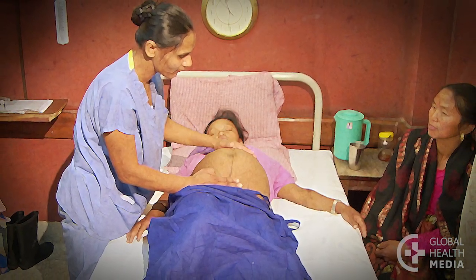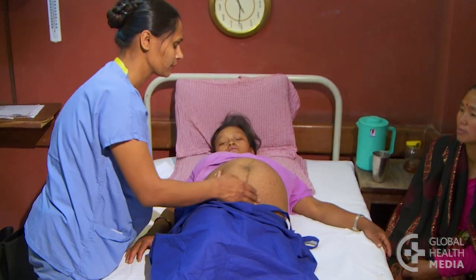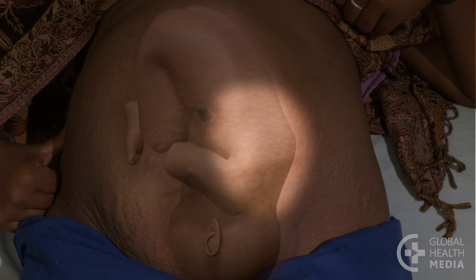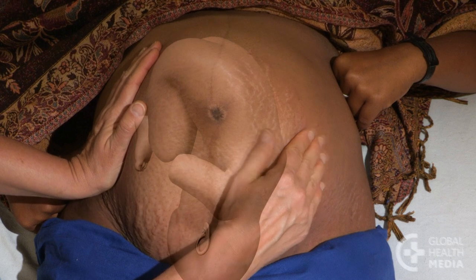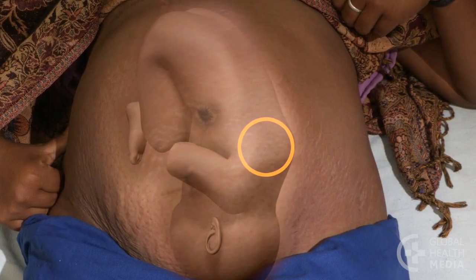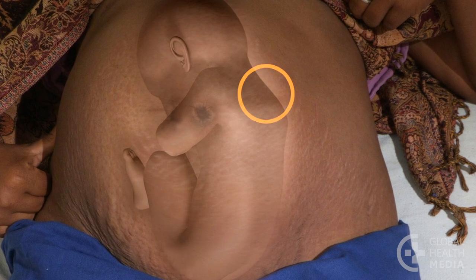How to assess the heart rate. First, find the best place to listen to the baby's heartbeat. It's usually easiest to hear the heart where the baby's back is. This will feel like a long, smooth, continuous shape in the woman's abdomen. In early labor, the baby's heart will be best heard below the woman's umbilicus. If the baby is breech, try finding the heart sounds a little above the woman's umbilicus.